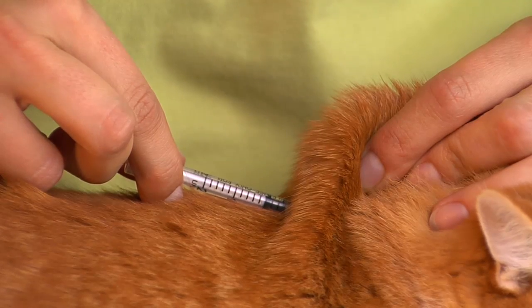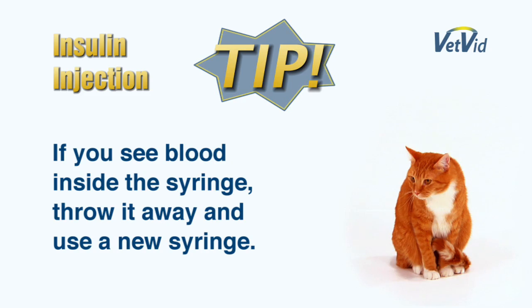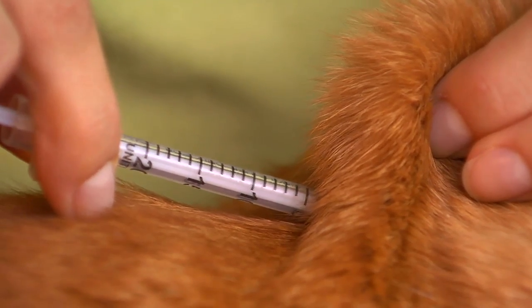Pull the plunger back a little bit to make sure no blood enters the syringe. If you do see some blood inside the syringe, you should throw it away and start over with a new syringe. Push the plunger all the way in and then remove the needle. It's that easy.